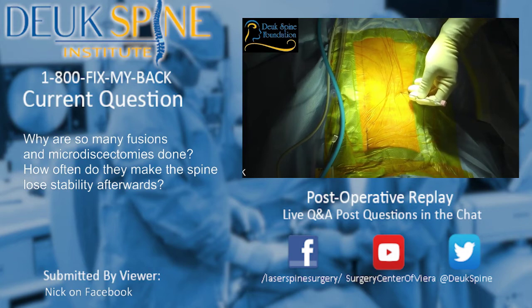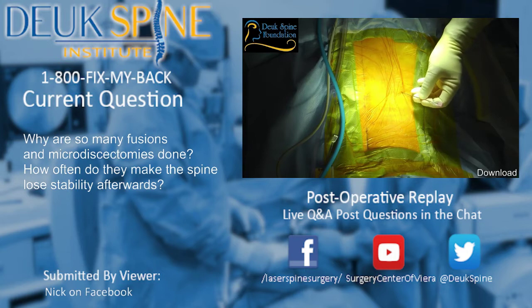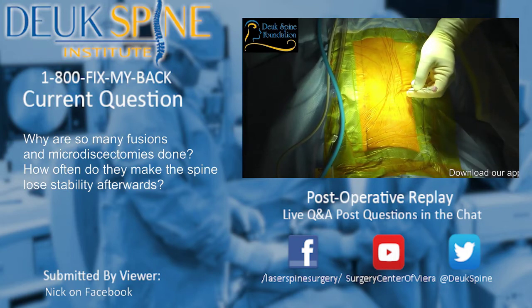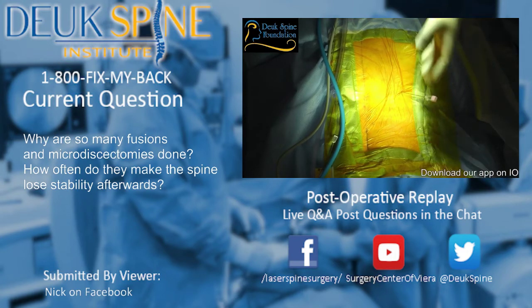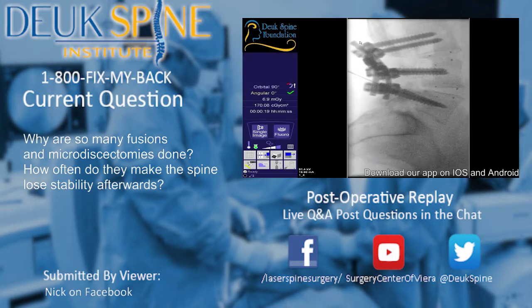Because we don't have to take bone, because we don't have to remove ligament, because we don't get the bleeding, because we don't have to retract the nerve. You saw where the nerve was at the end. It was just outside the retractor. And it's safe and protected as long as you do the surgery properly.